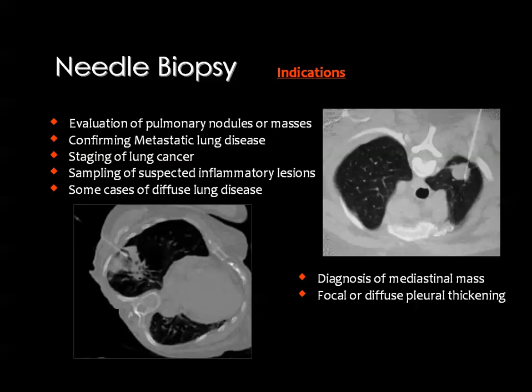Actually, I will handle here the issue of CT guided biopsy because this is the way I perform the interventional techniques myself, and I don't have enough experience in the ultrasound, and actually the MRI guided needle biopsies is not yet available in my country.